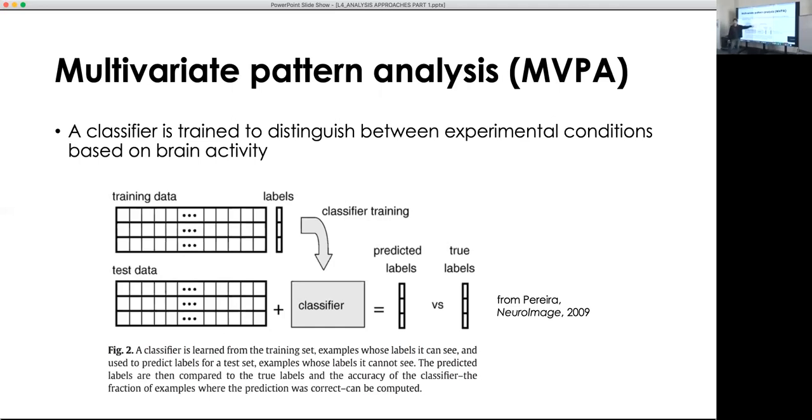We're gonna fit our model, our classifier, right? And we do some fitting, symbolize that with a little box. And then we go to some new data. Looks the same, right? A bunch of voxels, they have activity. This could be different trials or even different subjects, depending on how you wanna set it up.